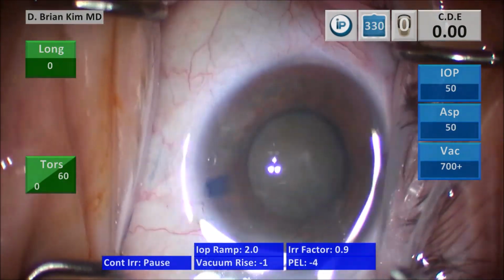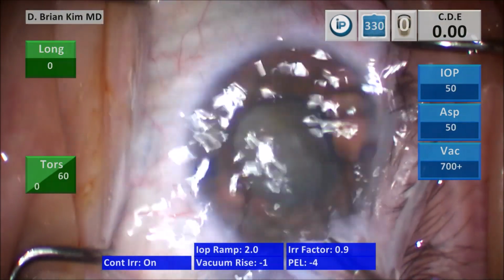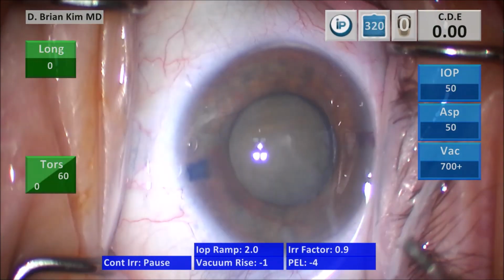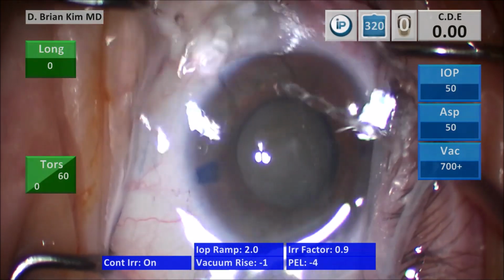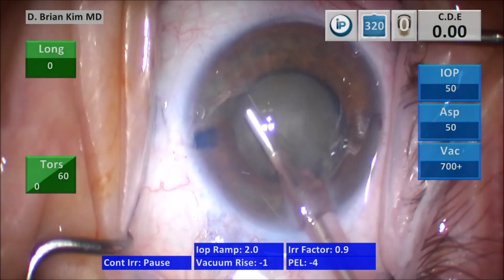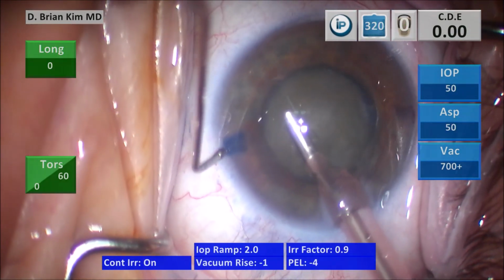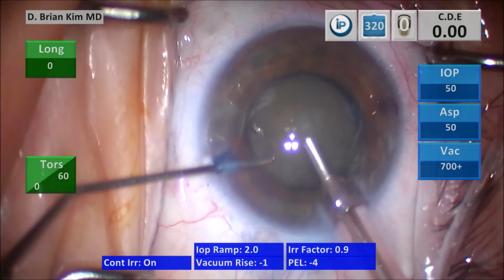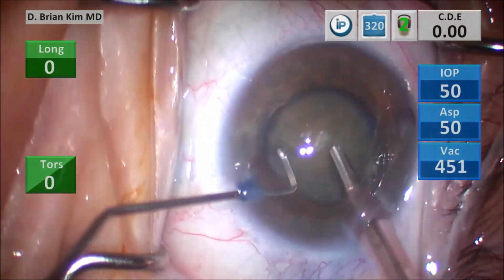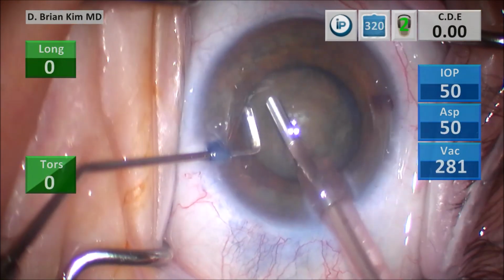Irrigate the surface of the eye, making sure my sleeve is of the appropriate length from the tip. In this dense lens, I like to have the sleeve a little bit more retracted. Lift the incision with the chopper, go in with irrigation off to minimize Descemet's trauma. Try to remove any surface epinuclear material if possible. Usually it's hard to remove that in a very, very dense lens.